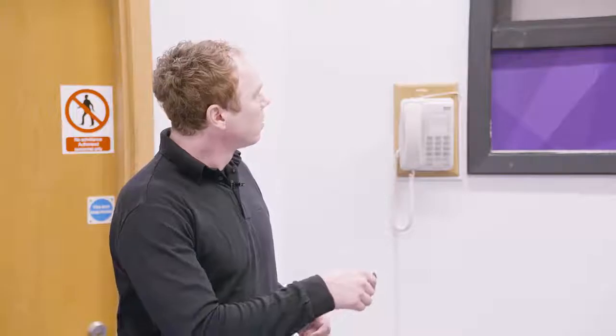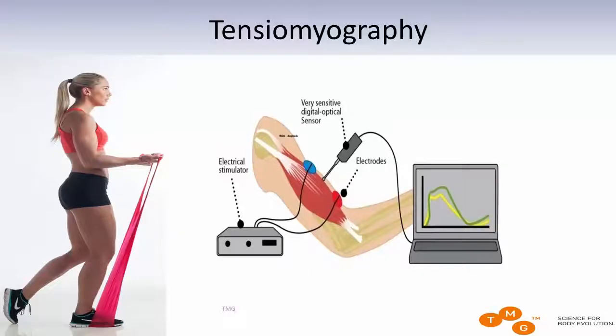In that case, we are using an electrical stimulator, and the goal is just to evoke one muscle twitch. For that purpose, the stimulus that is used is always the same. We are using the stimulator to send a 1 millisecond long monophasic square impulse, so the muscle will contract and relax one time, and the whole cycle is very fast.